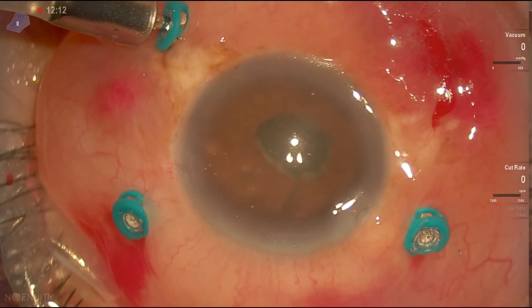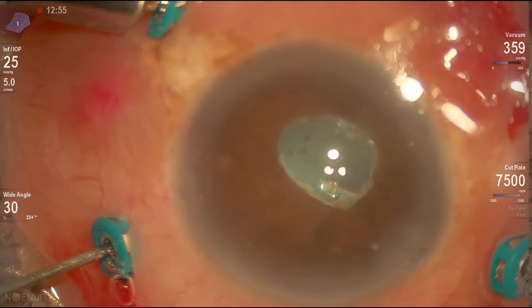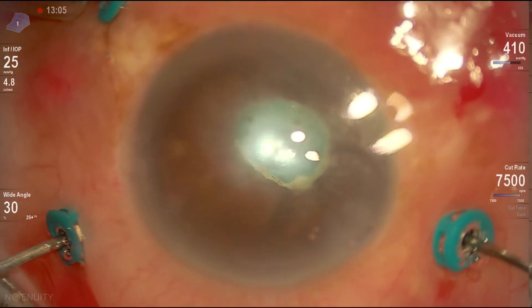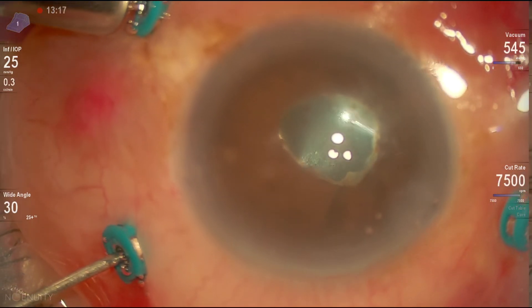Now we're placing viscoelastic in the eye to dilate the pupil and clear the anterior chamber. Pars plana vitrectomy is started again here, clearing the anterior vitreous from the debris present. You can see the red reflex through the opening we've made in the pupillary membrane.